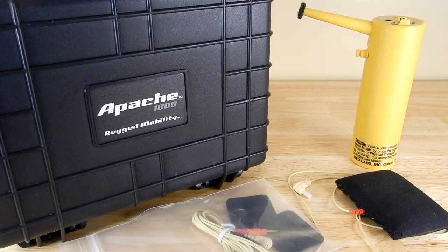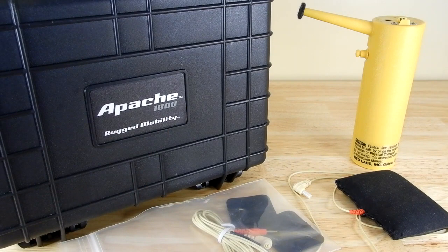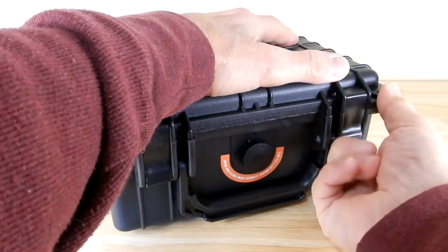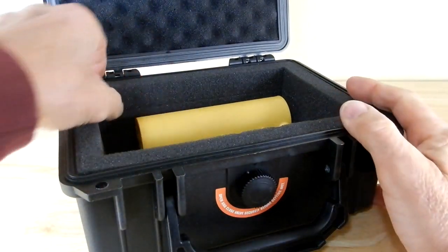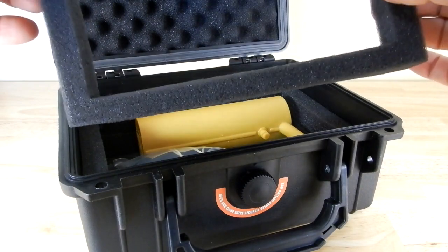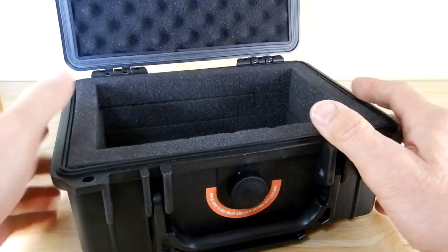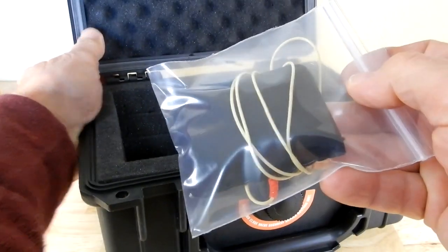To keep everything organized, in one place, and protected from damage, I bought from Harbor Freight one of their Apache cases — this is the 1800. I've done a review of their cases; they're very reasonably priced and very nice. I took out all the pick-and-pluck foam and just left the perimeter in for padding around the sides. The actual unit itself fits in there excellently, and I also keep the electrodes in there — the unused ones stay separate from the ones I've already used.